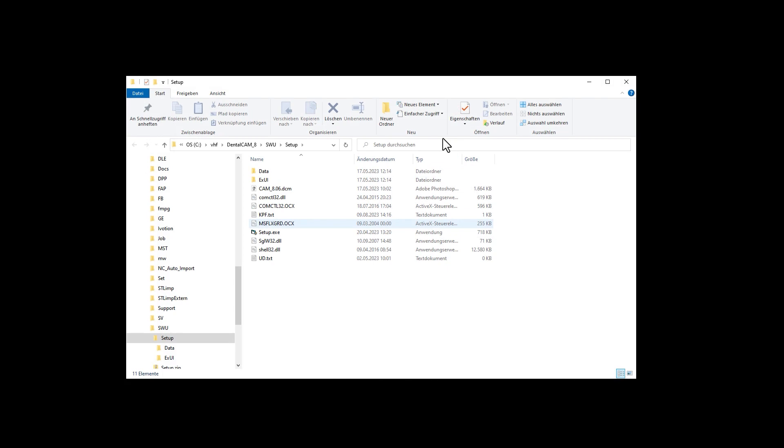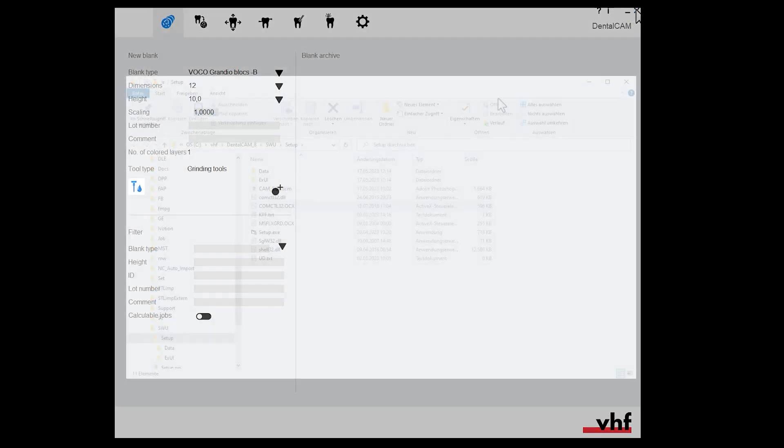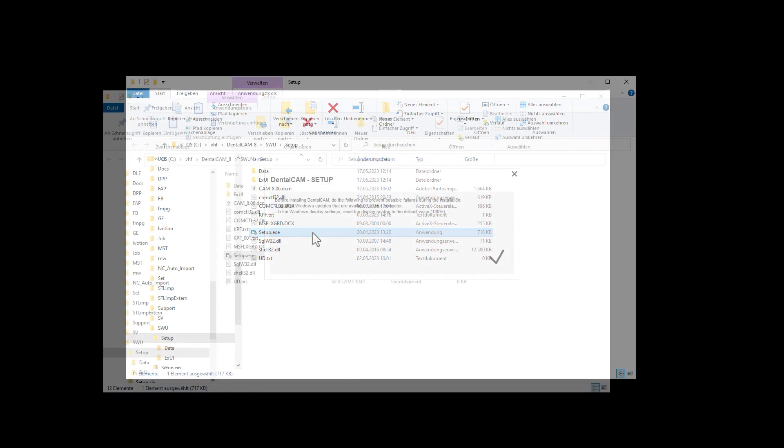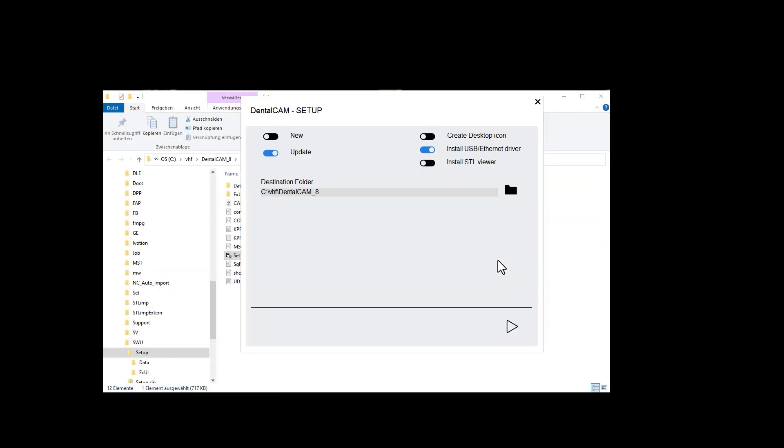The update folder opens. If DENTAL CAM is running, close it. Start setup.x. The setup window opens. Activate the update option. Start the update.